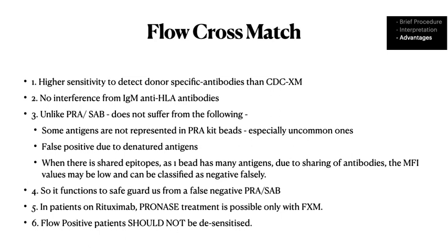When there are shared epitopes, as I've told you, due to sharing of the antibodies, the MFI values can be low for the PRA and SAB. So it functions as a safeguard against a false negative PRA or SAB. Again, in patients who are on rituximab, pronase treatment is an additional step that has to be used to find out whether the positive CDC is because of an antibody or not.